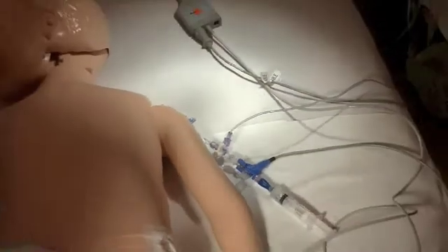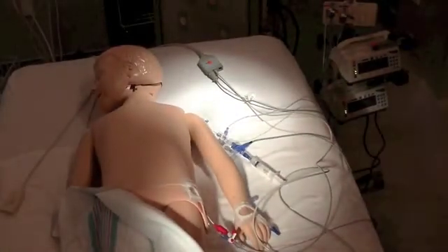With this setup you are now ready to turn on the PiCO monitor, calibrate, and perform thermodilution.